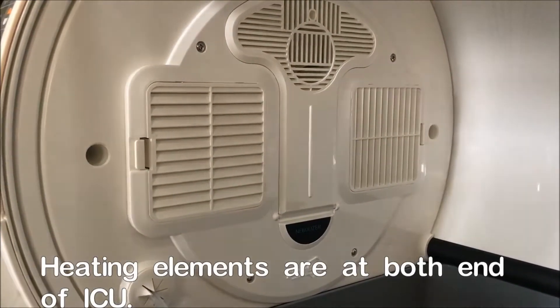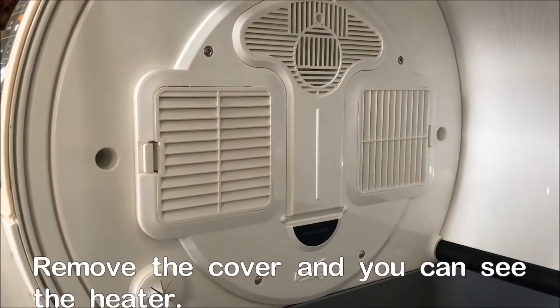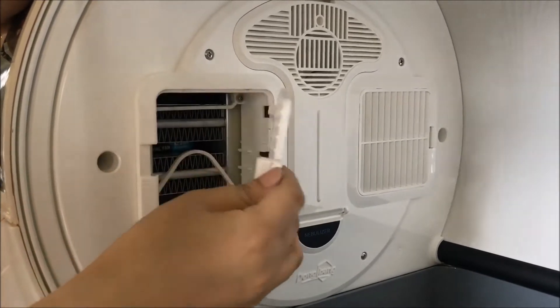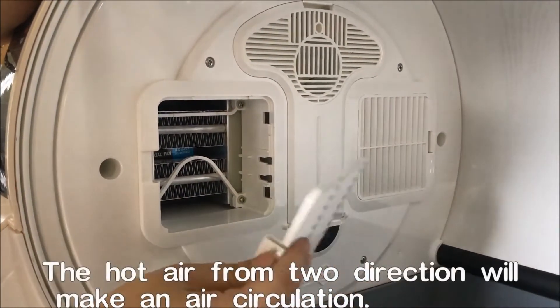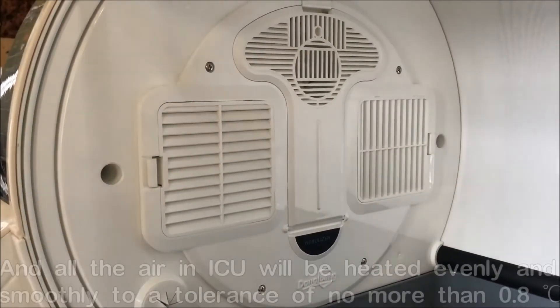On both ends of the internal compartment you can see there are square openings. When you open them, they reveal the heating element and the ventilation fan on the back — one is at the front left corner, the other is at the right rear corner.